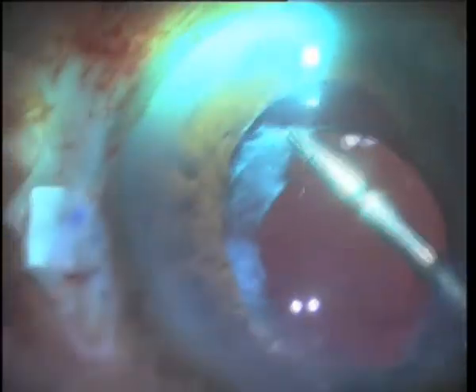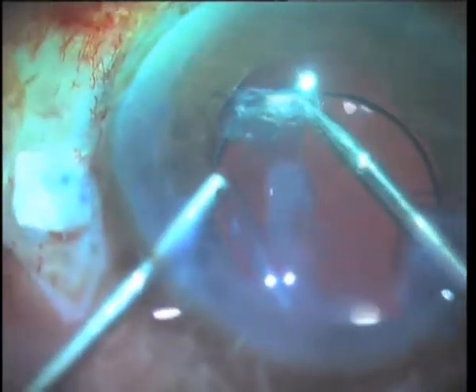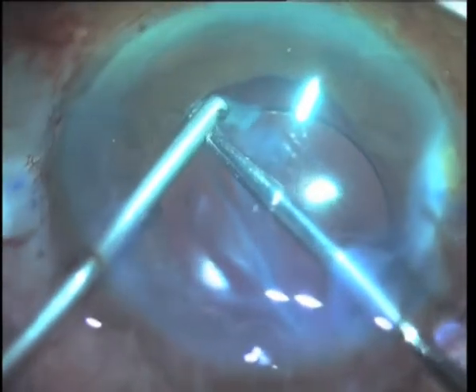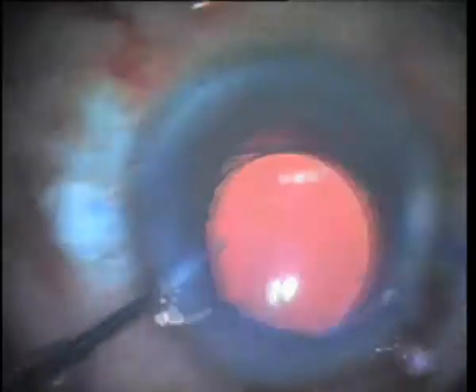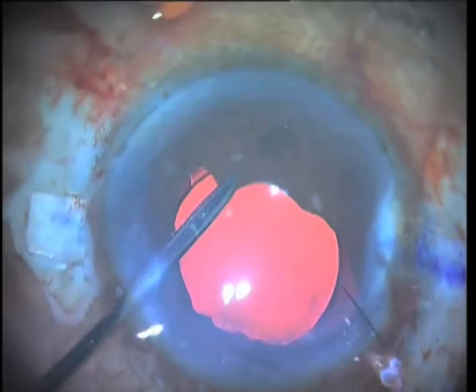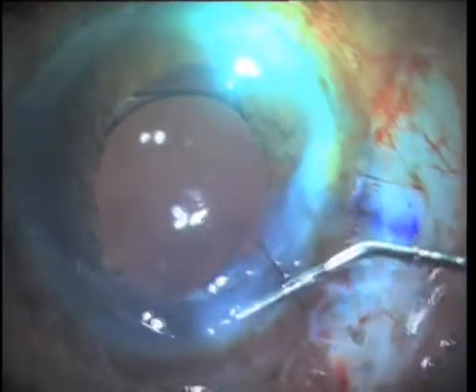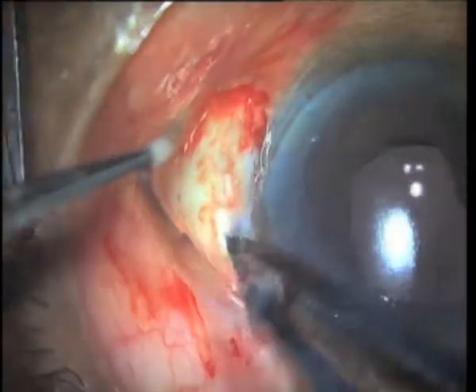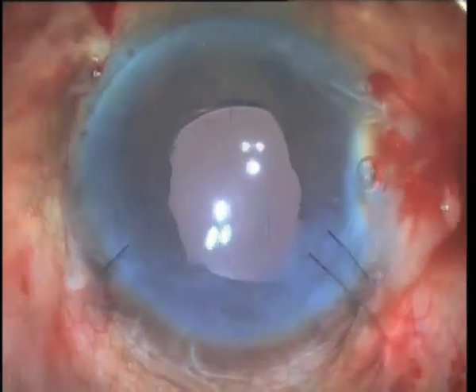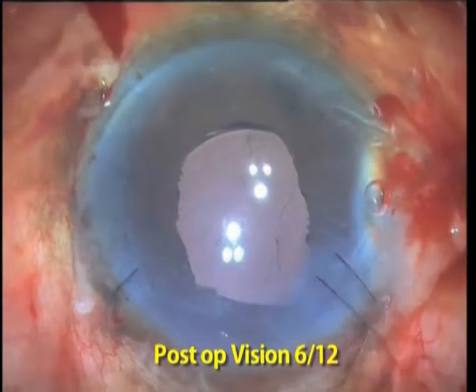Fibrosed capsular remnants and after-cataract are freed and removed with the vitrector. Upon confirming centration and stability of the IOL, the scleral flaps and the conjunctiva are secured with fibrin glue. The post-operative picture is of a clear cornea, a formed anterior chamber, and a well-centred IOL, enabling the patient to enjoy greatly improved vision of 6/12.